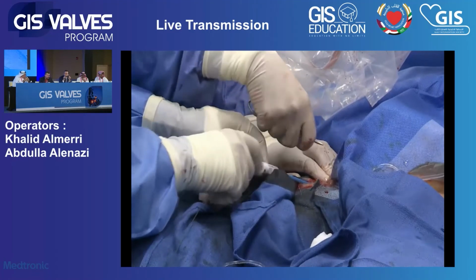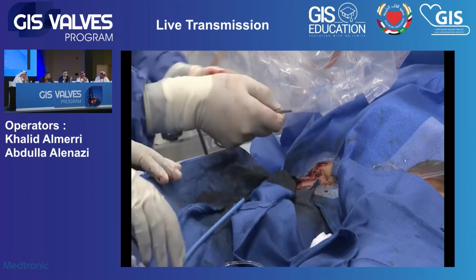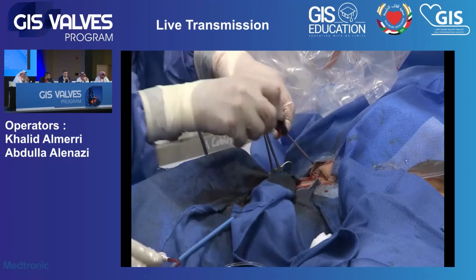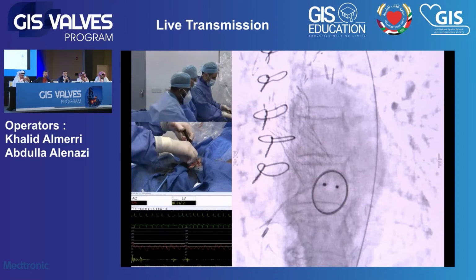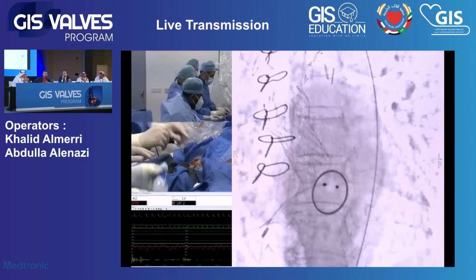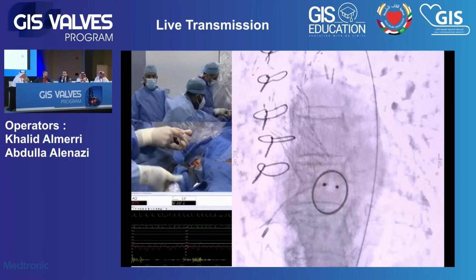Can I just make this comment, Dr. Arif? Whoever was in Paris for the EuroPCR, probably in the innovation session, has seen the Gemini device, which is basically like rotablation for the coronaries, but it's debulking the aortic valve. It's a very smart, intelligent invention. Really, I think it's the future. Perhaps we use the Gemini to start with and then deploy the TAVI whichever way.